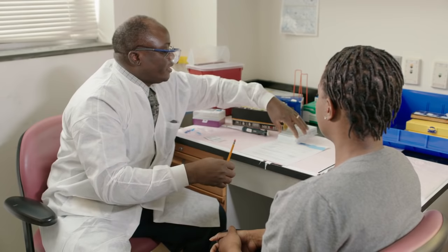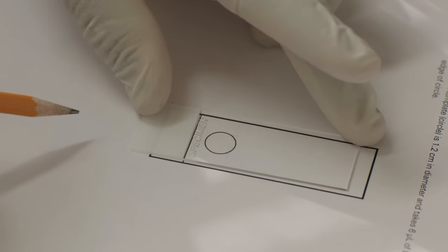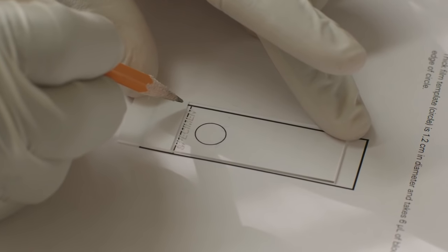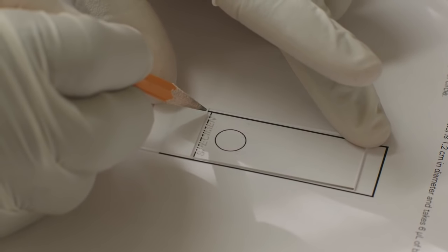First of all, let me get the slide. I'm going to label the slide with the patient's name, the date and time of collection of the sample.